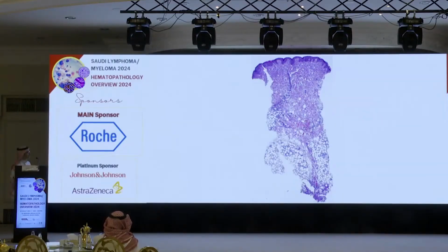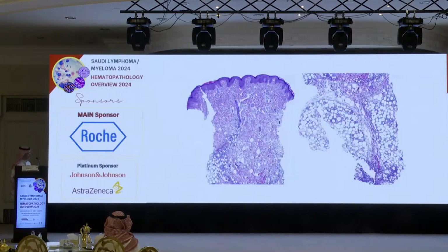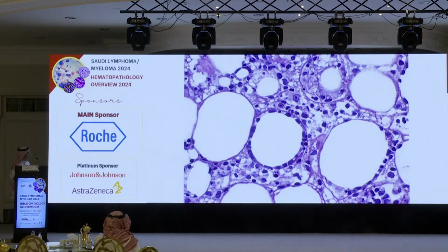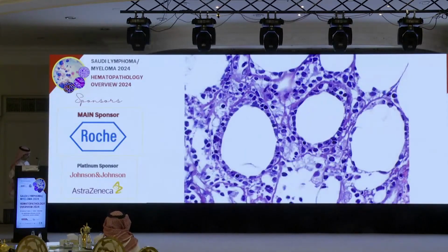As you see, there is inflammatory infiltrate, lobular, in the subcutaneous. This is higher power view, so the infiltrate is primarily in lobular pattern in subcutaneous fat. There is no significant involvement of epidermis or dermis, so it is restricted to subcutaneous. This is a higher power view, the atypical lymphoid infiltrate rimming the adipocytes. Again the same, and this is another one with the rimming atypical large lymphocytes.